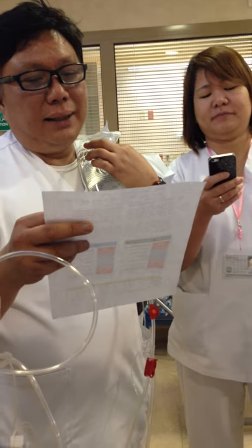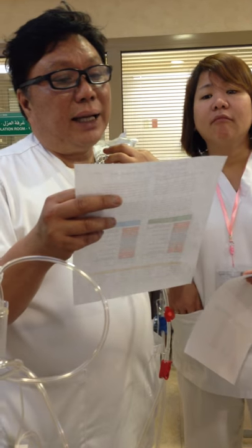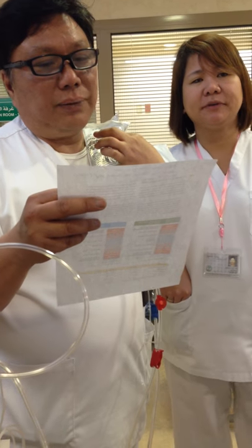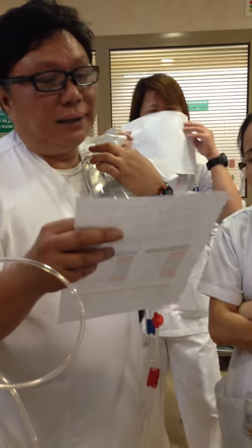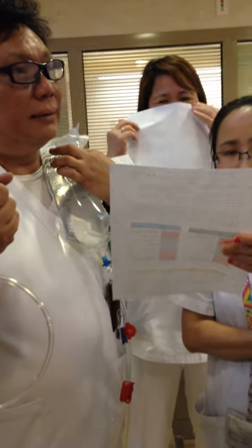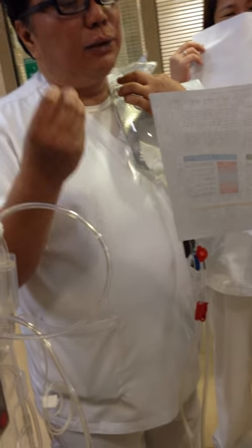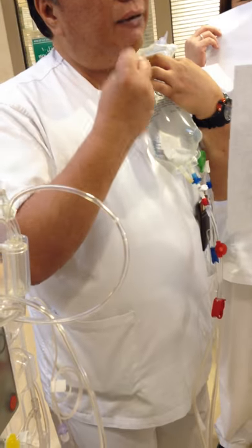As your citrate is mixed with the blood, it reduces the concentration of the ionized calcium. Explain further. Ionized calcium is essential for what? Clotting. The clotting mechanisms need ionized calcium, which is referred to as a blood clotting factor.